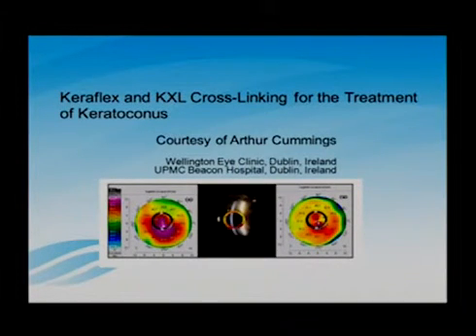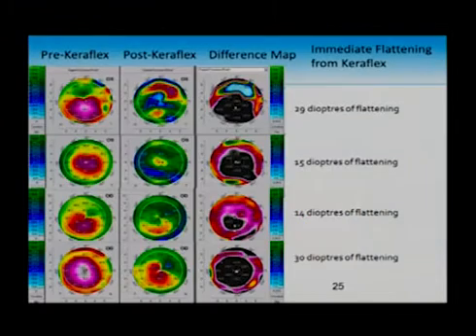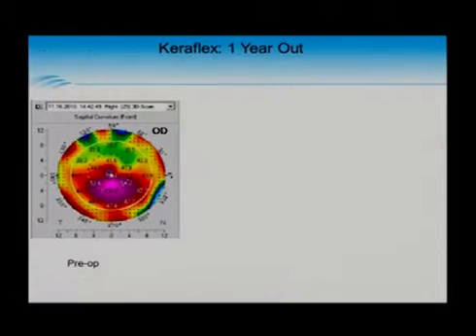I did want to show you a few cases that Arthur Cummings shared with me. He's treating patients in Dublin, and he now has almost 1 year of follow-up on some of these keratoconus patients. So we can start to see that we are getting good stability and long-term effect on these keratoconus patients. Here's the immediate difference maps on some of these, and these are very steep cones. Some of these patients were not tolerating a hard lens anymore and were considering keratoplasty.